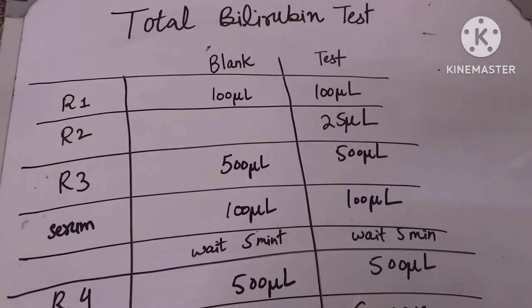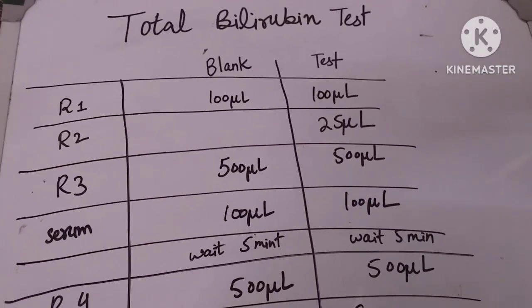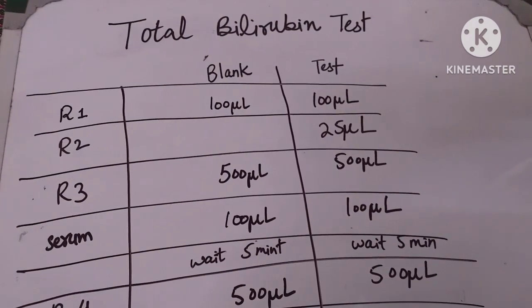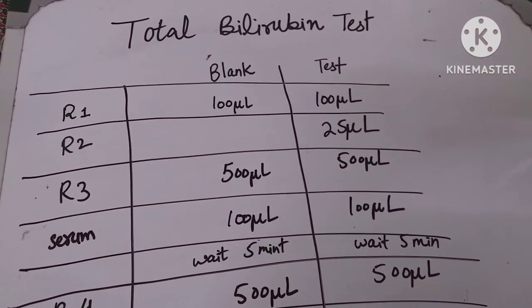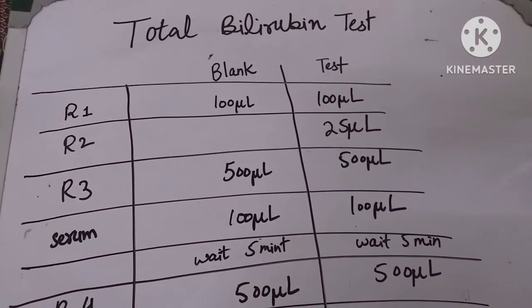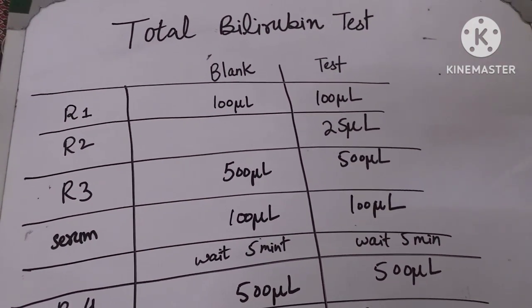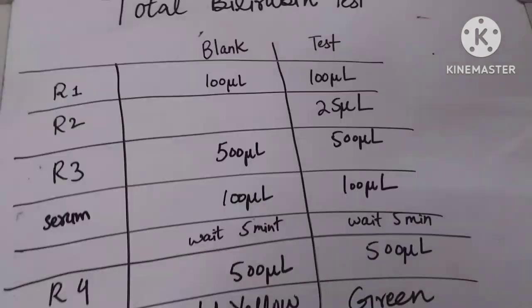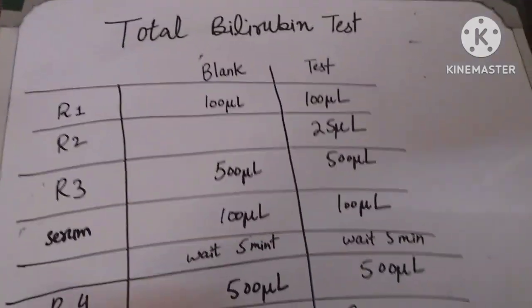In this video, we will learn how the total bilirubin test is run on the Microlab 300. The total bilirubin test has four reagents in total.